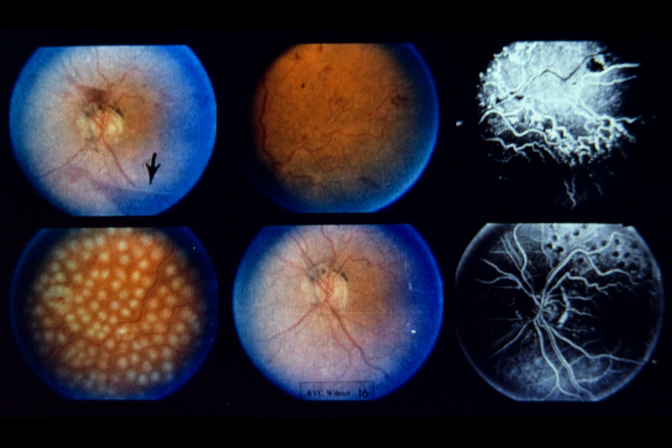Lower left, note pattern of scatter argon laser photocoagulation applied to superior temporal fundus. Lower center, 2 months following photocoagulation, note complete regression of disc neovascularization. Lower right, note absence of disc neovascularization on fluorescein angiogram. Chorioretinal scars are visible above disc. Visual acuity remained 20/20.